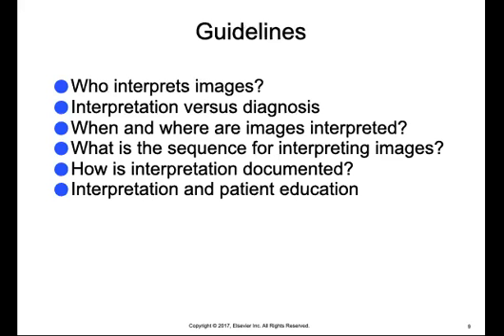Some of the guidelines include who interprets images, interpretation versus diagnosis, when and where images are interpreted, what the sequence is for interpreting images, how the interpretation is documented, and interpretation and patient education. And just note there is a difference between interpretation and diagnosis. So you can interpret images if you have the proper training, but as a dental auxiliary, you will not diagnose. And the dental radiographer needs to be familiar with each.